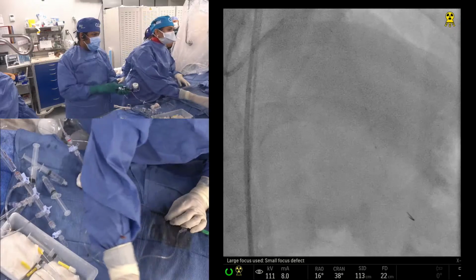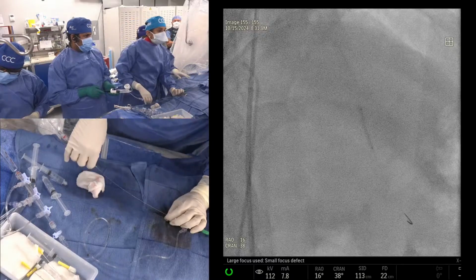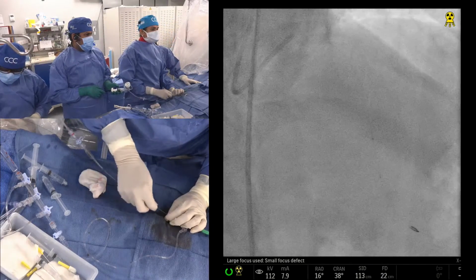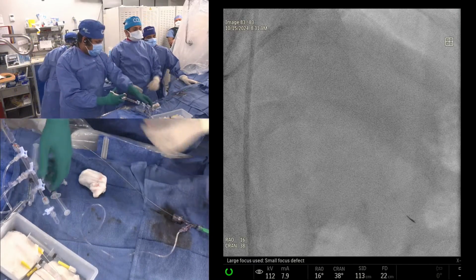And this is the kind of case people are doing nowadays: you have all this diffuse disease, you just leave it with a drug-coated balloon. Ours is a trouble because it's a very expensive strategy. If you have to put in two drug-coated balloons, you're 10,000 down. The hospital has to apply for some loan. Done? You want more pictures? No, we have to decide now.